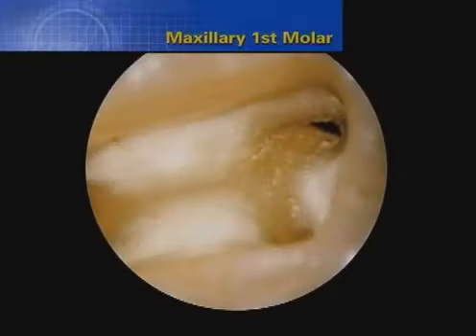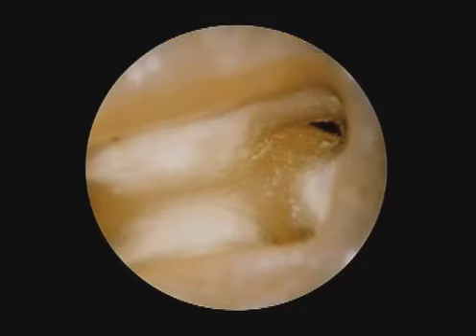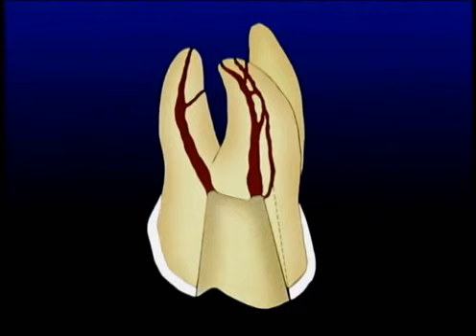A working film shows the instrument at length. Oftentimes, a lip of dentin meets the pulpal floor and forms a groove. Many colleagues are probing tenaciously in this groove to find the MB2 system, but it needs to be recognized that the second canal is under this lip of dentin, and this lip of dentin needs to be removed with ultrasonics. In this graphic, we can see this shelf of dentin is oftentimes formed by the abrupt angle where the MB2 canal enters the pulp chamber floor.